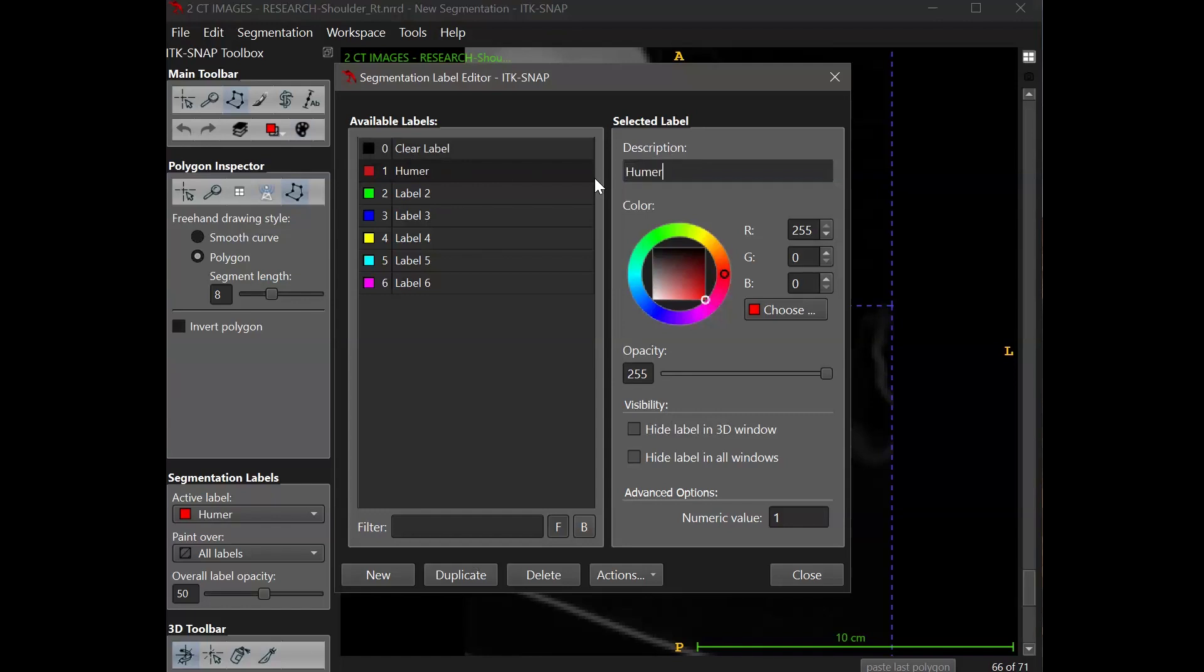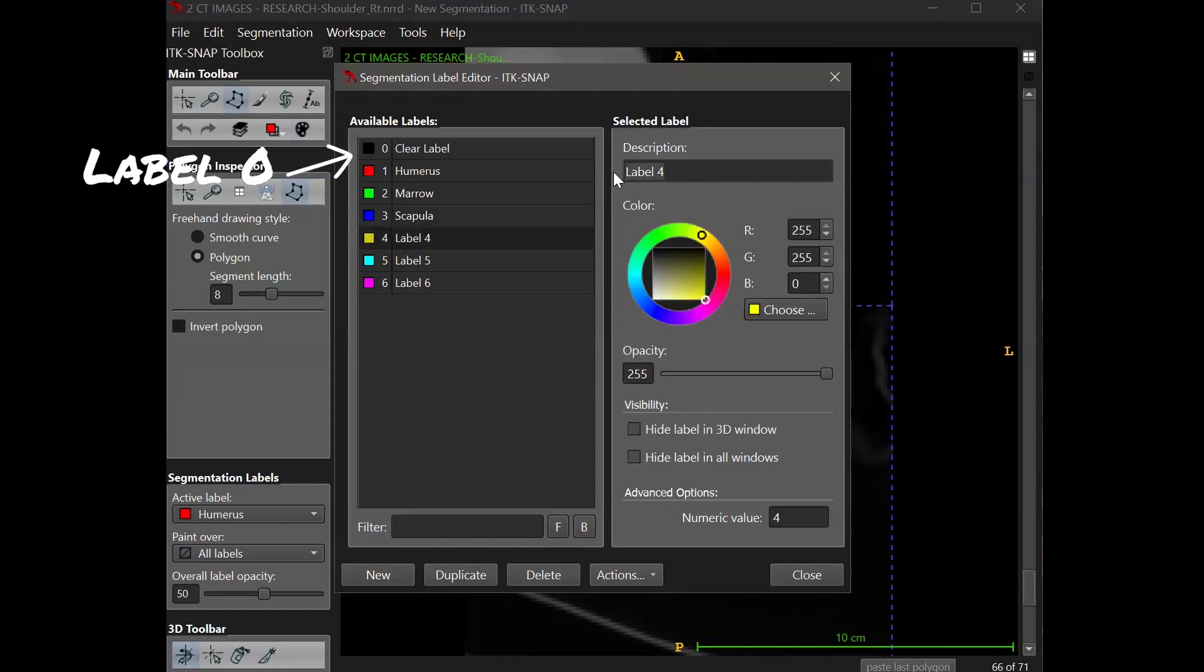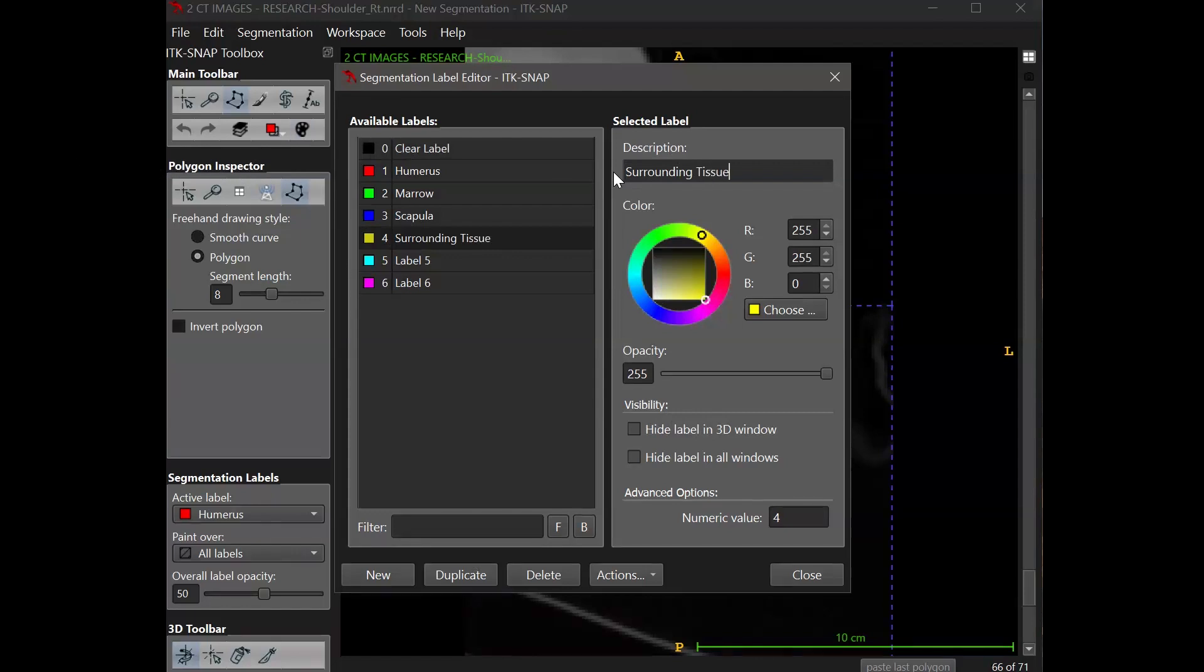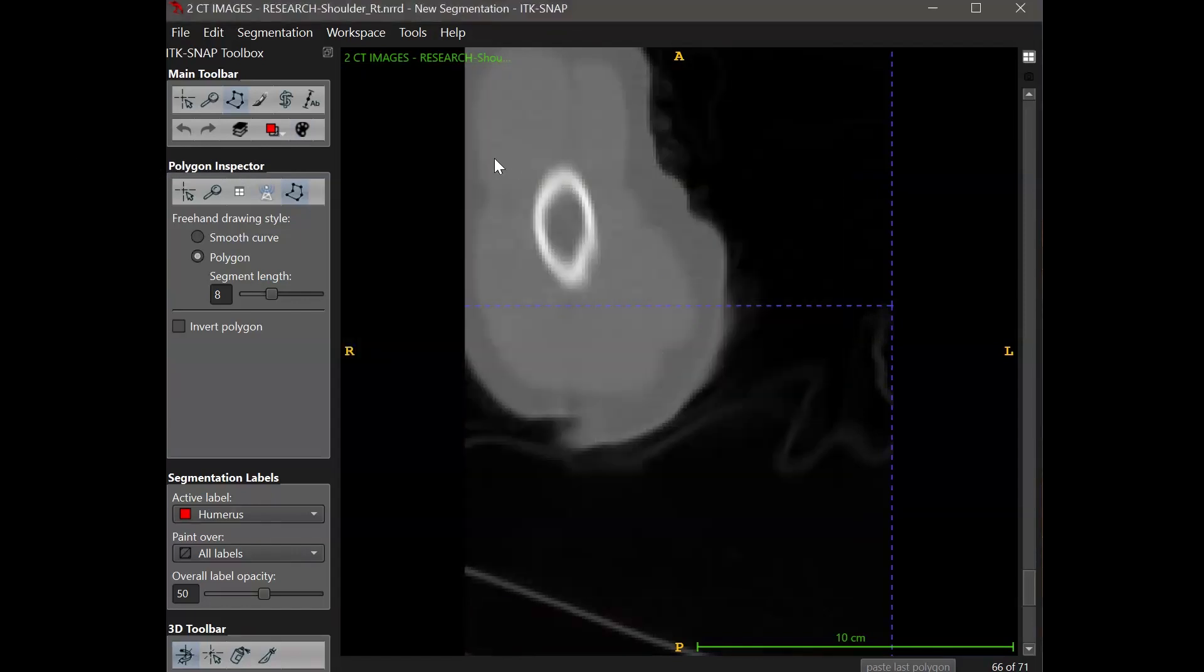One important thing to note is that the image starts off with a default label. Everything starts off with a default label that's called label zero. So label zero means it's not part of any segment. And if you paint with this label zero, you can think of it as erasing rather than adding to a segment.